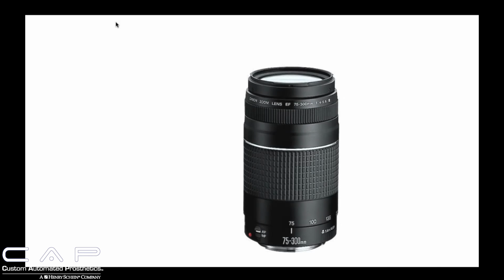So here we have a zoom lens, and when I first started taking photographs, whether it be work on the model or whatever, that's all I had was a zoom lens, and I thought that maybe I could make do with this. Well, a zoom lens is not meant for macro photography. Some of these lenses have like a macro feature, but that's not the glass, and the lens setup was not designed for macro photography.